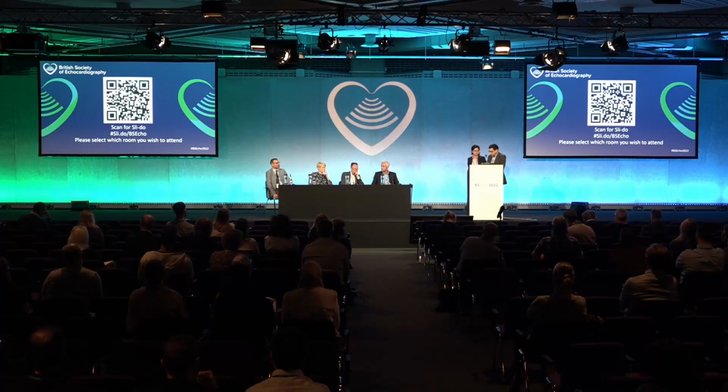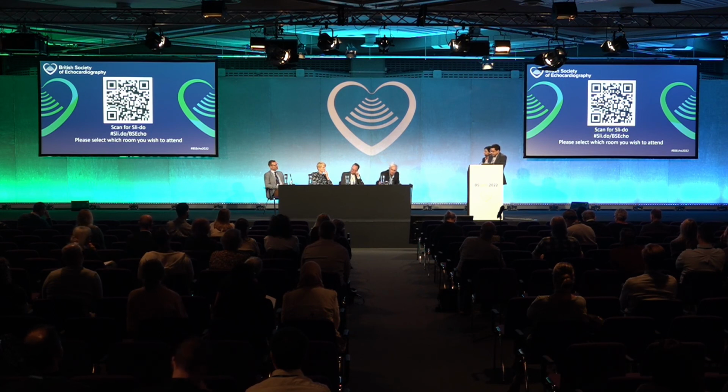Perfect, thank you very much. Question for Stephanie. Do all BAV patients have aortopathy? And if they have an aorta which is not dilated, do they need surveillance of the aorta?